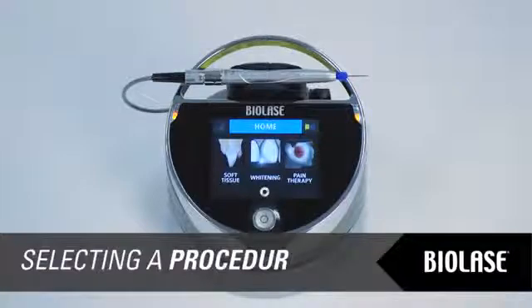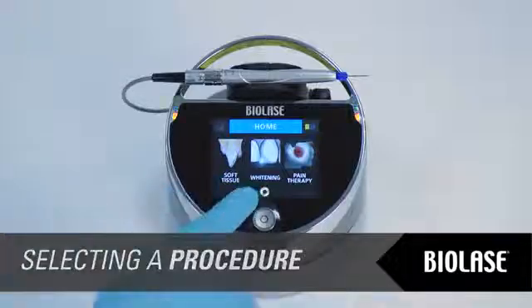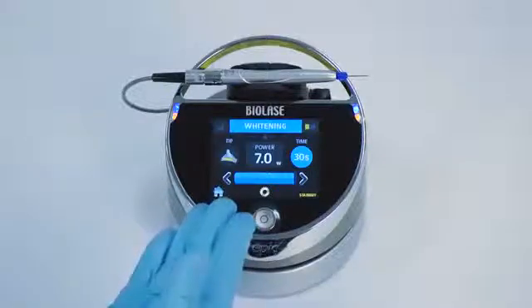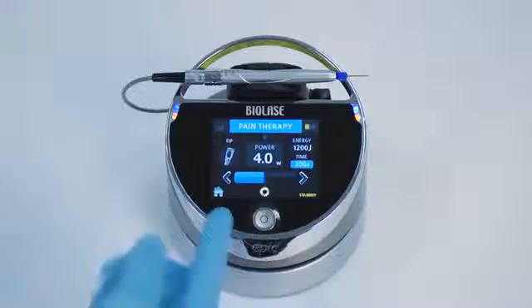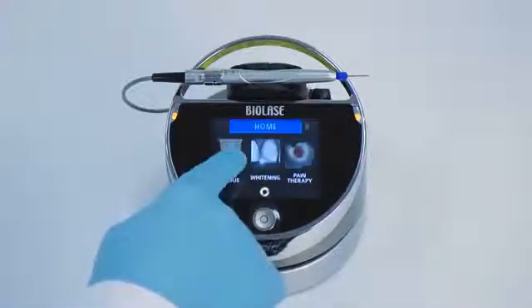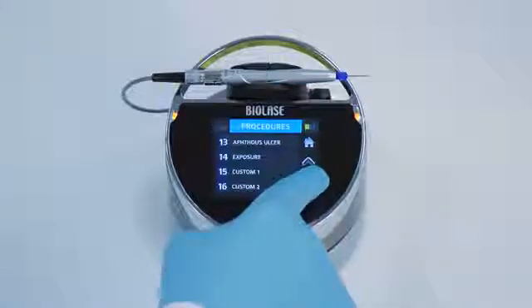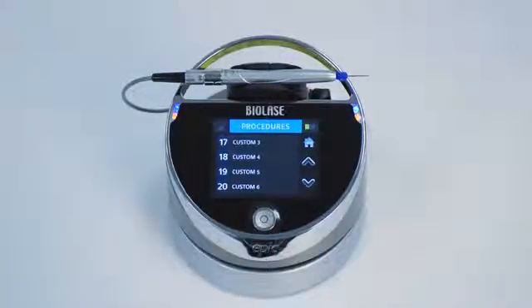The EPIC touch screen display is a streamlined interface for operating the EPIC. There are three treatment modes — soft tissue, whitening, and pain therapy — accessible from the home screen. When you press whitening or pain therapy modes, you will enter a single screen with adjustable settings. When you press soft tissue mode, you will enter a procedure screen. From this scrollable list of procedures, you can select 14 preset procedure settings or 6 custom procedure settings.